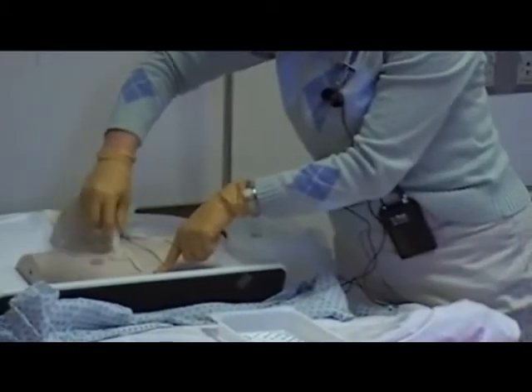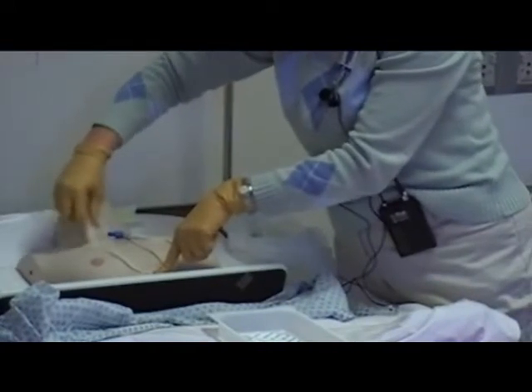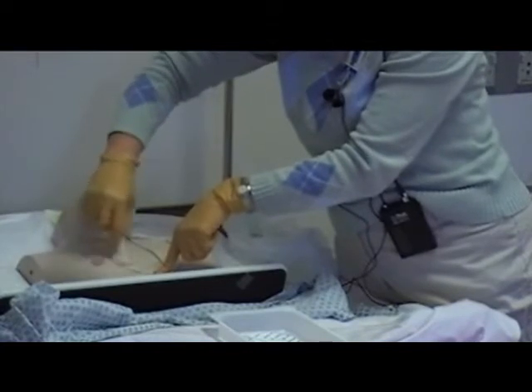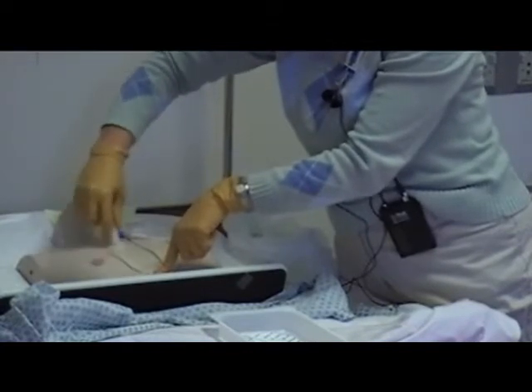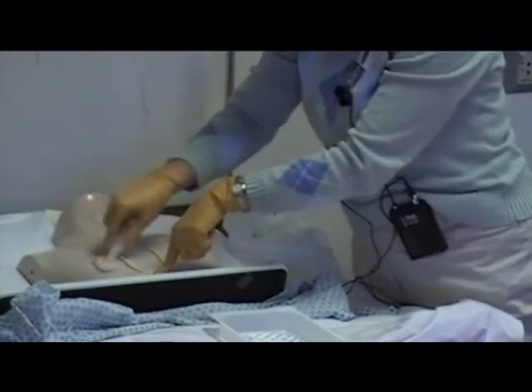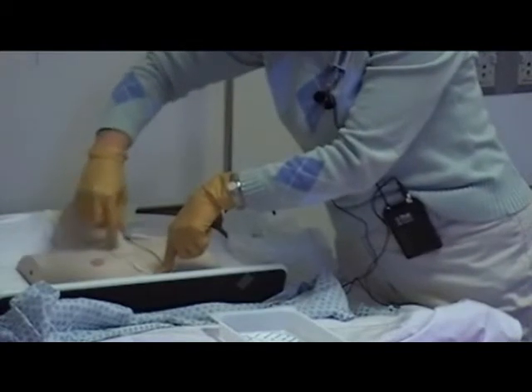Okay. Now my hand that I had just placed on the catheter to also stabilize the catheter is now no longer sterile. Okay, and I'm doing that because I don't want the sutures to come loose. So a 30-second scrub, back and forth, and you will scrub vigorously, applying friction.